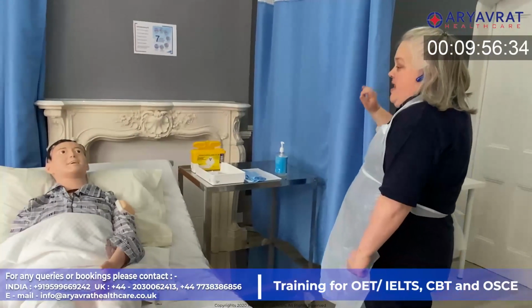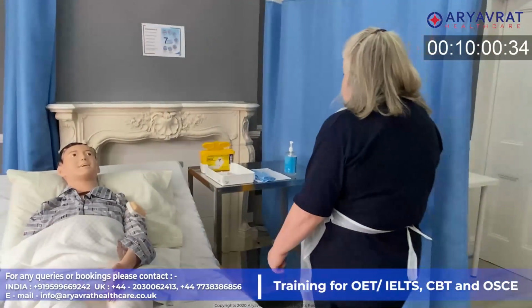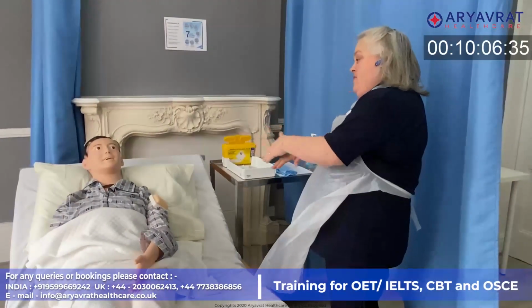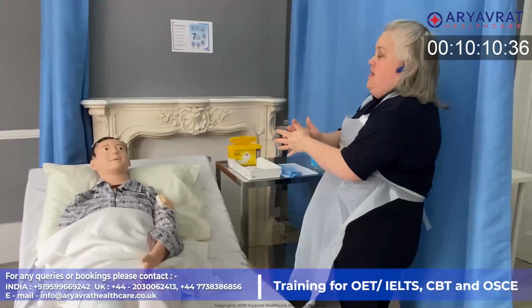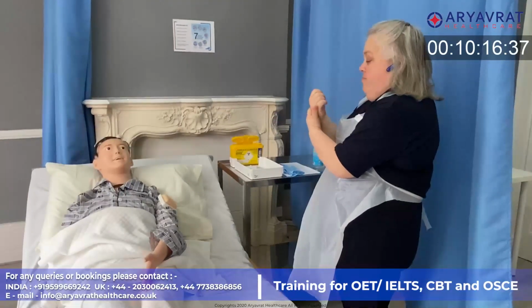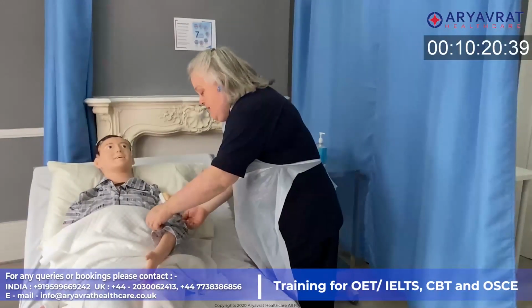Hi Fred, I'm back. Hello. I've got a clean apron ready. So Fred, I'm on your left side, so would it be okay to have a look at your left arm? Okay. Okay, I'm just going to roll your sleeve up. Will it come up? Lovely.